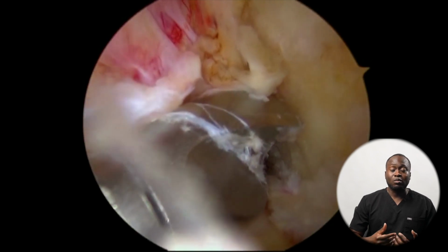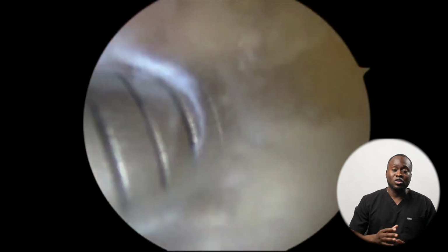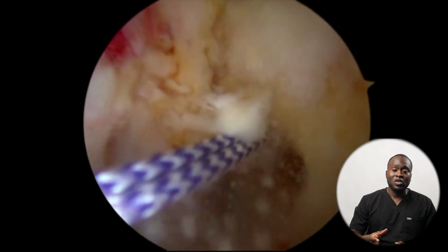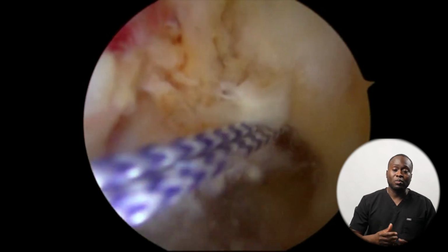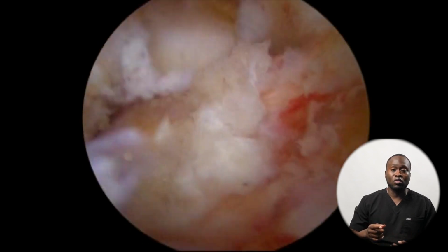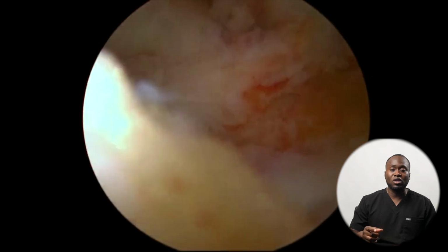So in my practice, I start off drilling the femoral tunnel first, on the femur, and we drill that through to just the right depth for that individual patient, all right? We can then take some stitches, some sutures, and pass them into that tunnel as kind of a holding place. We're gonna use those sutures later on, so we put them in there just to hold them for a second. We then go to drilling our tibial tunnel.